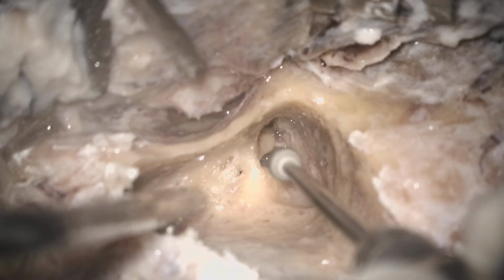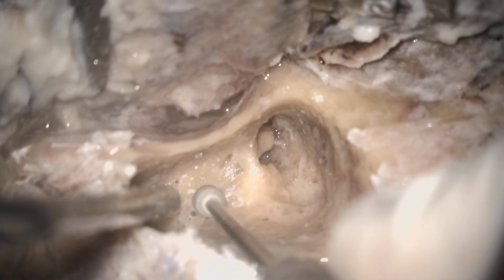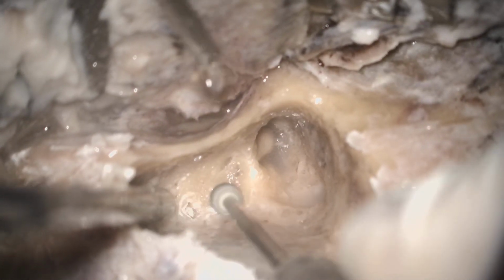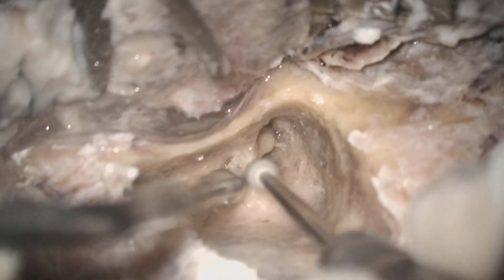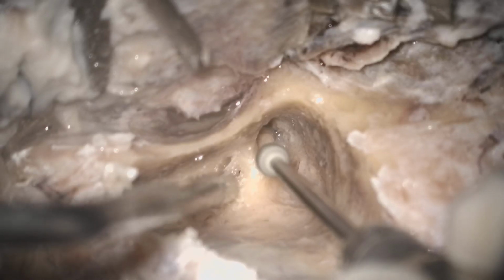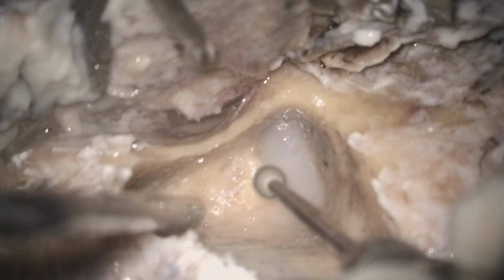Okay. So now drill. So this is the facial nerve coming. The first glimpse, the first appearance of the facial nerve. Look. Okay. Can you appreciate? Can you visualize the facial nerve? Absolutely. Yes, so this is the first glimpse of the facial nerve. So the facial nerve will go up to the tip cell in that region.